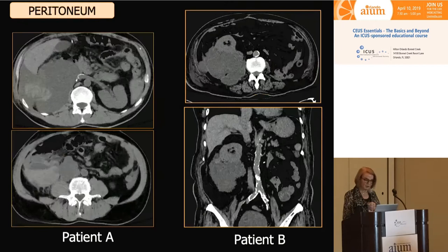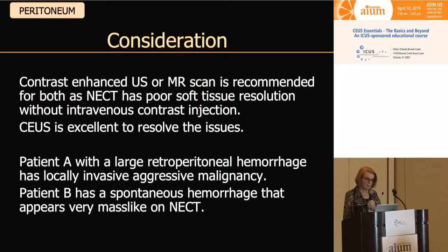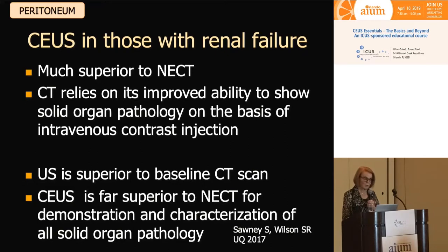An avascular benign lesion — hematoma. Comparing these two patients, both presenting with a retroperitoneal mass: Patient A has hyper-enhancing nodules throughout that mass with infiltrative carcinoma in the peritoneum, while Patient B shows an avascular mass representing a hematoma. Contrast-enhanced ultrasound in those with renal failure is far superior to unenhanced CT scan. CT relies on improved ability to show solid organ pathology based on intravenous contrast. CEUS is far superior to NECT for demonstration and characterization of all solid organ pathology.